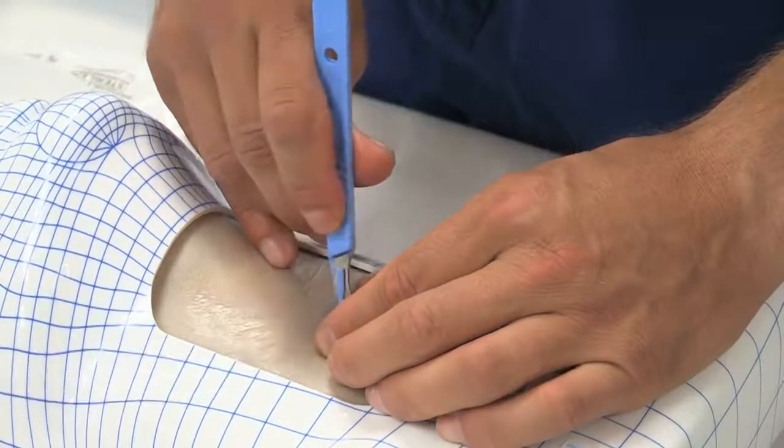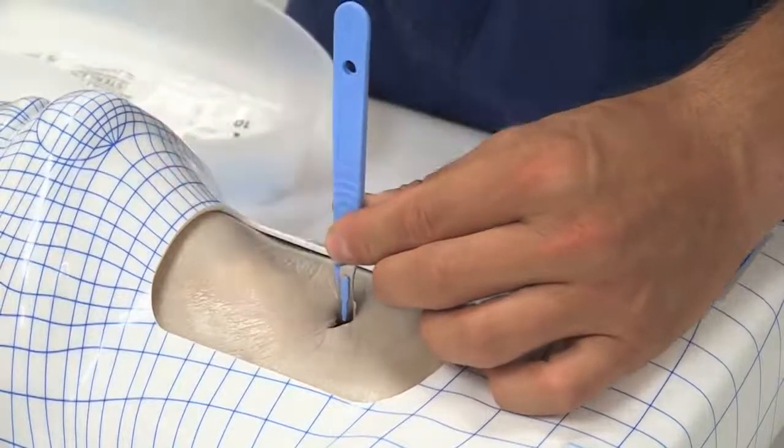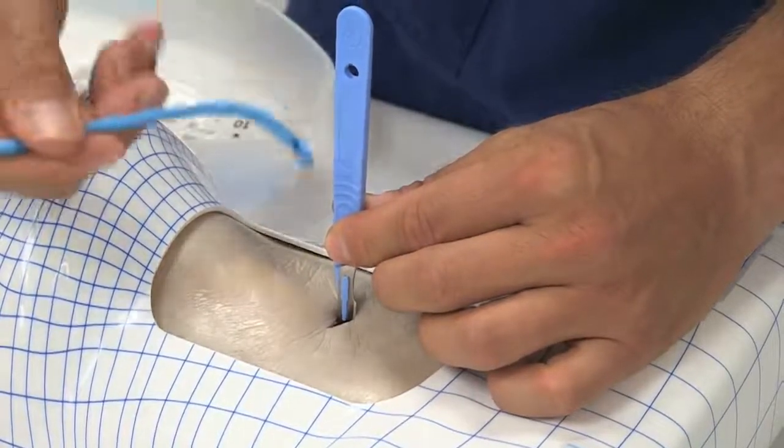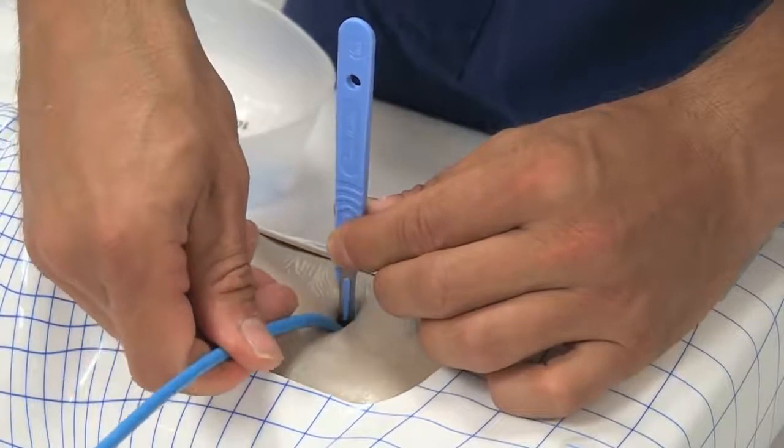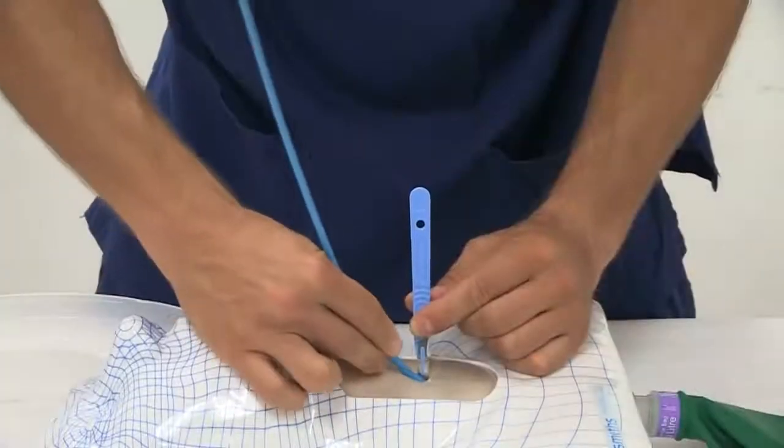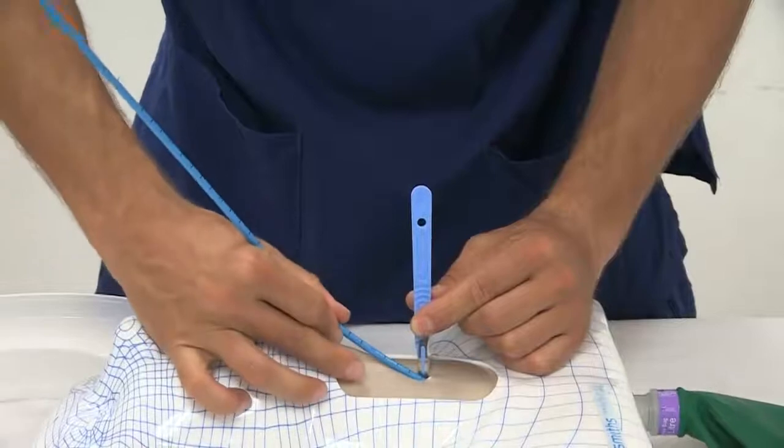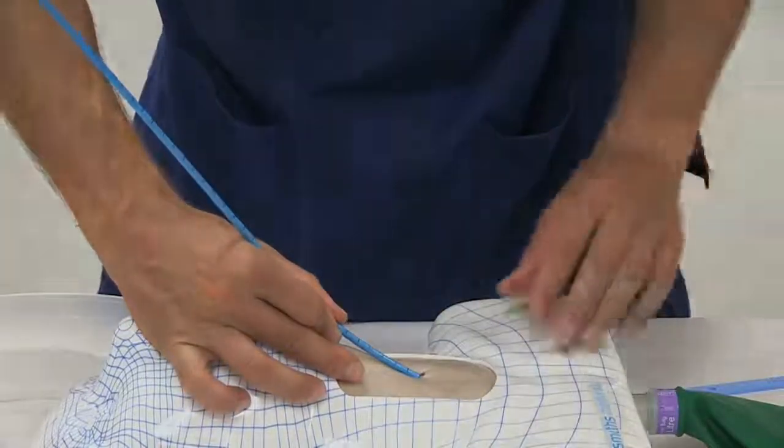While advancing the bougie, tracheal rings can often be felt. If tracheal rings are not identified, it may be necessary to feel for hold up of the bougie to exclude gastric or pre-tracheal insertion. This should be again performed with gentle two finger pressure only.